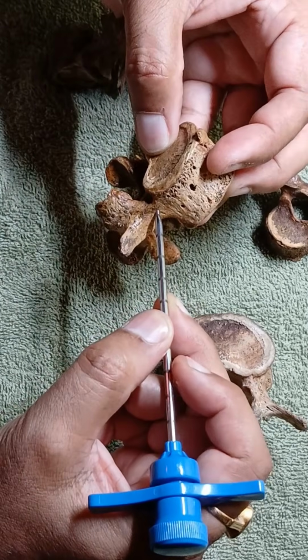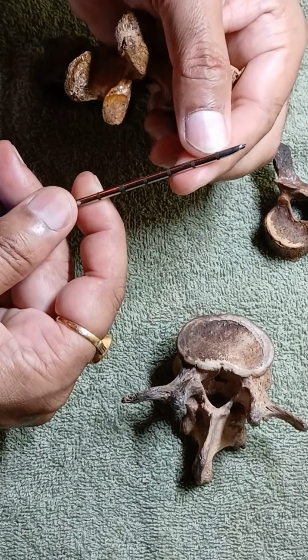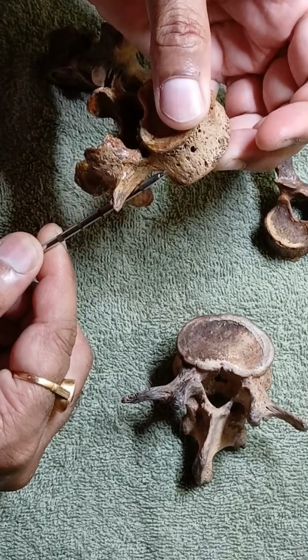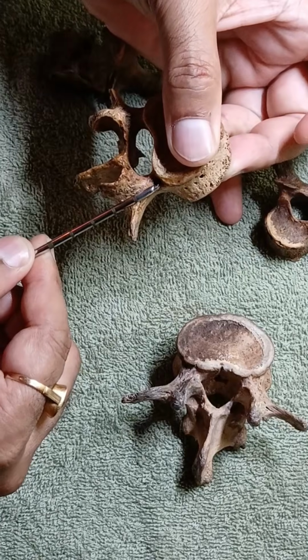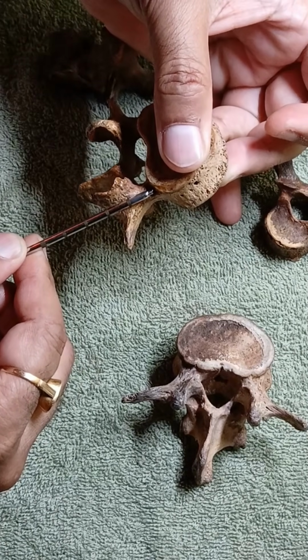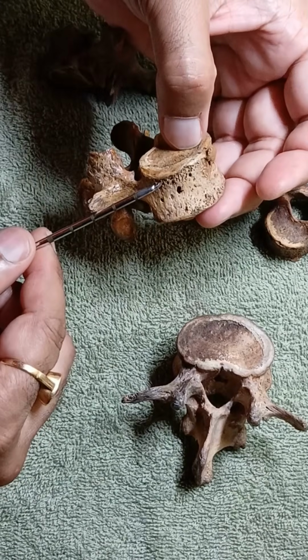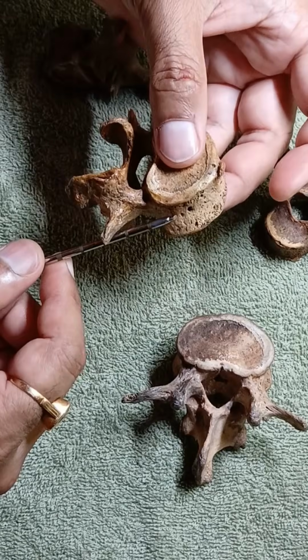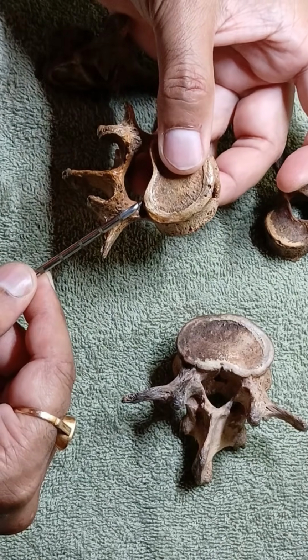In reality it's not more than 1 centimeter, the markings are here. So not more than a centimeter. This centimeter journey is so crucial, because once you are entering into the body, then it becomes a little safe. So now your trajectory will be like this.